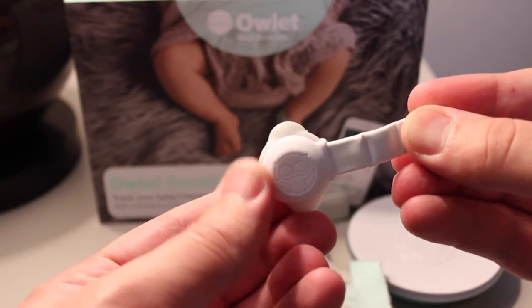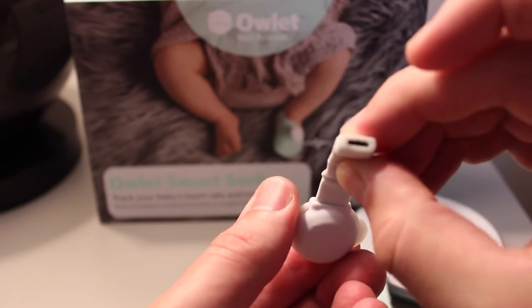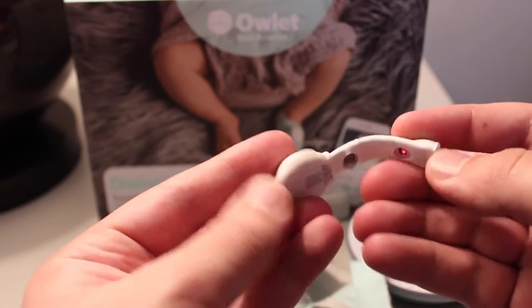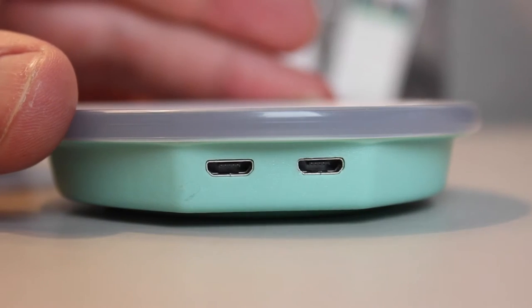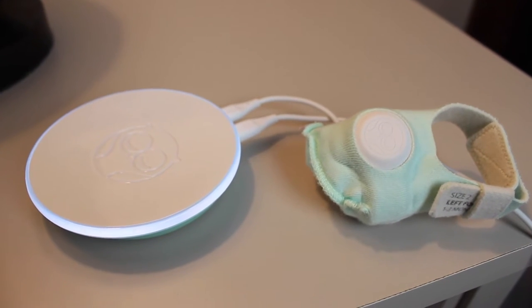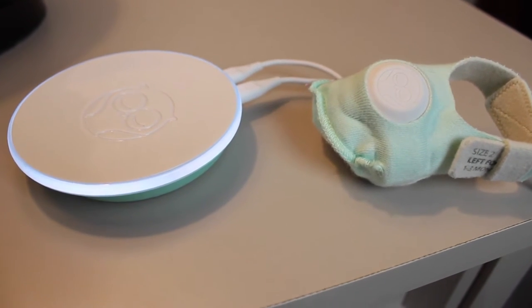The sensor itself has a pretty good battery life — it will get you about 21 hours of continued use. And when your baby isn't sleeping, you can either turn the sensor off or just plug it into the back of the base station, which will immediately start charging your baby's sensor.